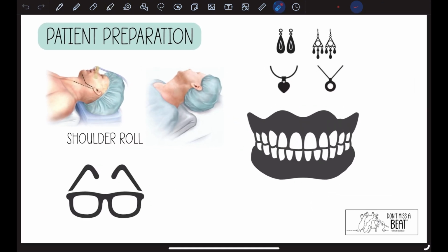First of all is patient preparation. So remember, this is taking images really above the chest, which normally for your peripheral procedures in the legs and your cardiac procedures, you clear the chest and the legs, but you don't really think about above the head. And there's a lot of equipment that we have on the patient. There's a lot of things the patient might have that you need to be considerate of.